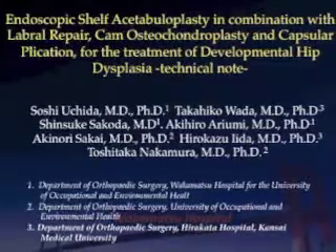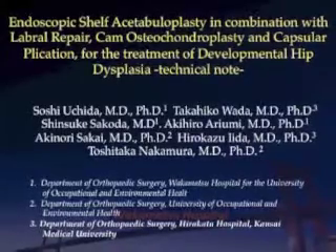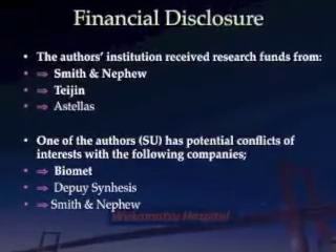This video shows endoscopic shelf acetabuloplasty in combination with labrum repair, cam osteochondroplasty, and capsular plication for the treatment of developmental hip dysplasia. The technical note.